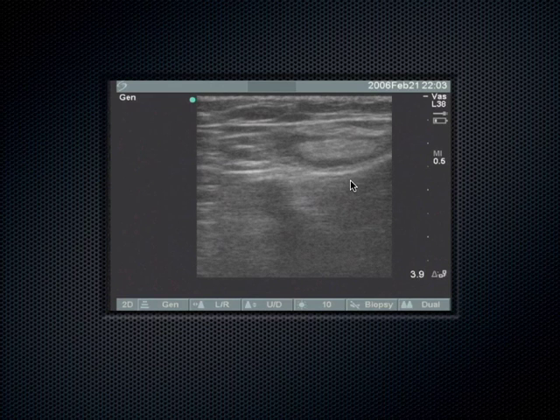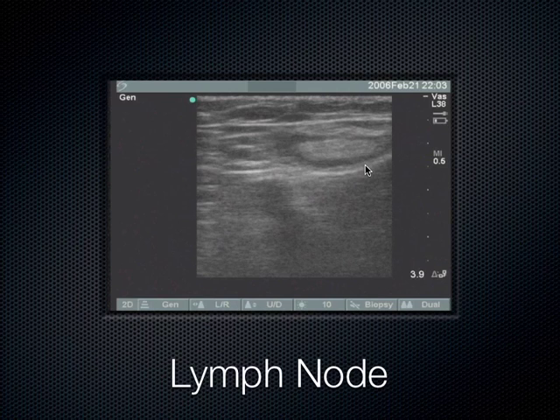This is a very enlarged lymph node. And we see that in cases of infection. So there's an infection downstream, down the leg, maybe somewhere around the calf. The skin's kind of red, the leg is kind of swollen. And then you don't see DVT, but you see a really enlarged lymph node. It helps sway you clinically towards cellulitis or infection and away from DVT. That's an inguinal lymph node. Correct. Inguinal lymph node. That's enlarged. Prominent. Usually you don't really see them. But this one looks like a little miniature kidney or something.